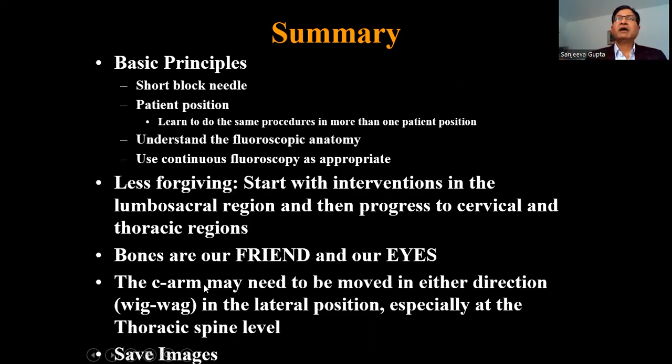Bone is your friend and your eye. So when doing any procedure, land on the bone, especially if you're not using a gun barrel technique, like when we do radiofrequency denervation of the cervical medial branches in lateral position or even in supine position. My default position is lateral position, as I said.